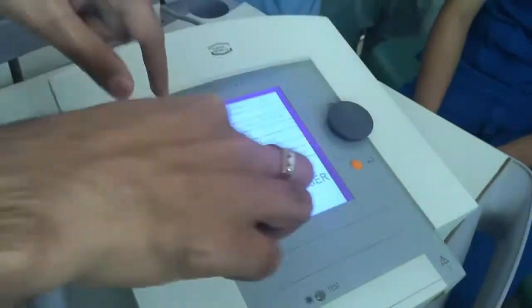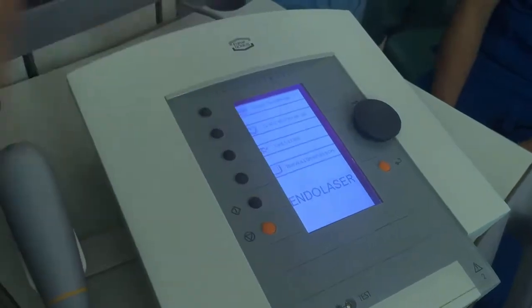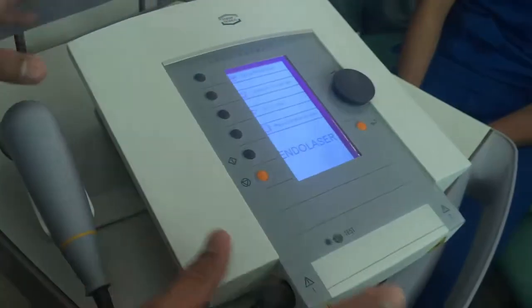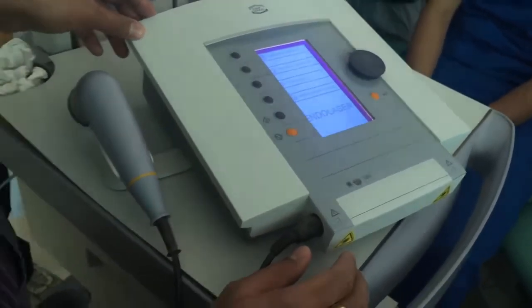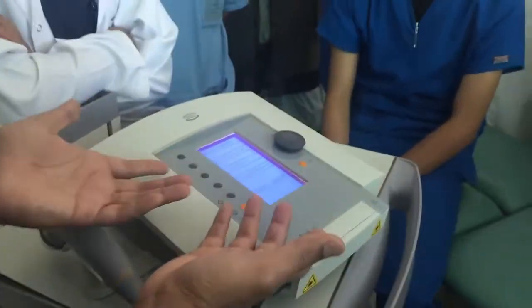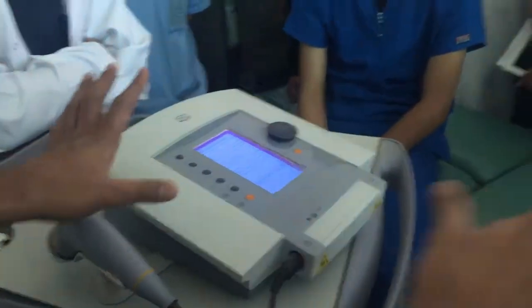All these things have gone down inside. It should be up. So press a little bit hard, properly. So 1, 2, 3, 4, you press, it will unlock. We will test, inshallah, on this device. This is for a practical purpose. It's not for treating patients, it's just for showing you. Okay?